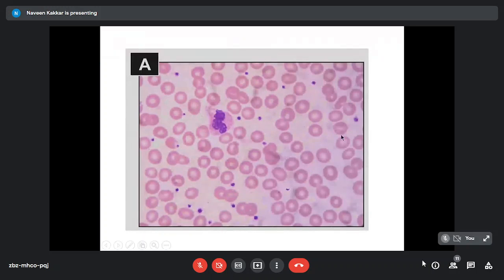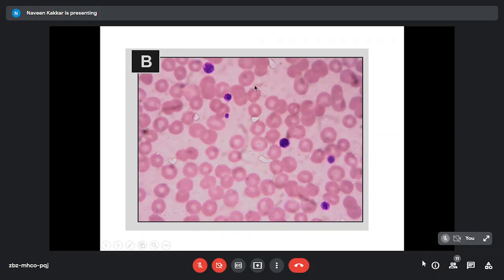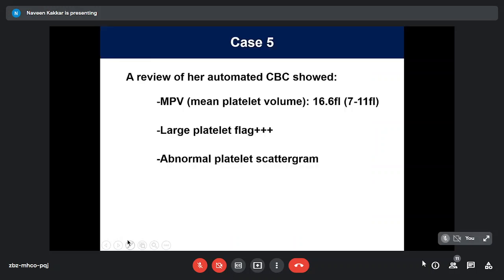So that's a smear from a normal patient, in which you see the neutrophil, and if you look at the platelet size, it's pretty much normal, 2 to 5 femtoliter volume. In this patient, there are no lymphocytes here. These are all platelets. 1, 2, 3, 4, 5, 6. Very large platelets. This one almost reaching the red cell volumes. So large and giant platelets were seen in this patient.